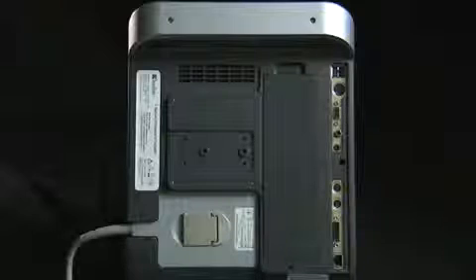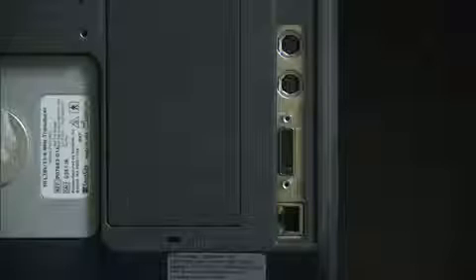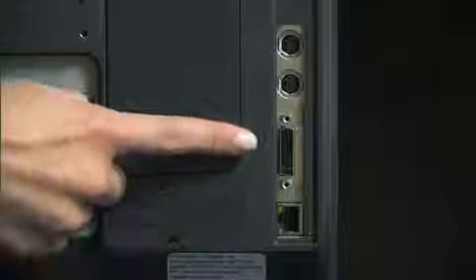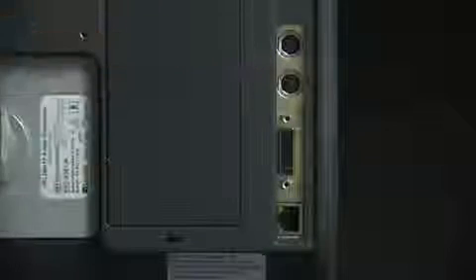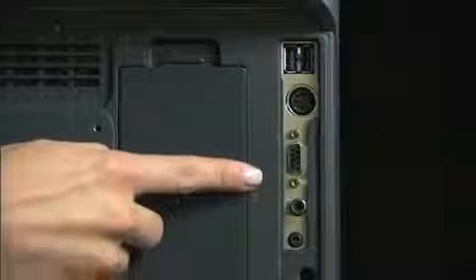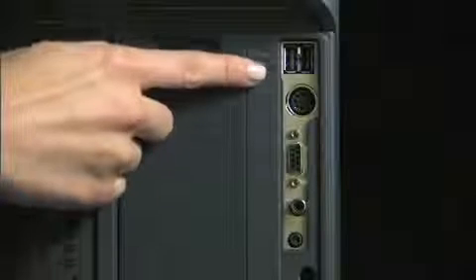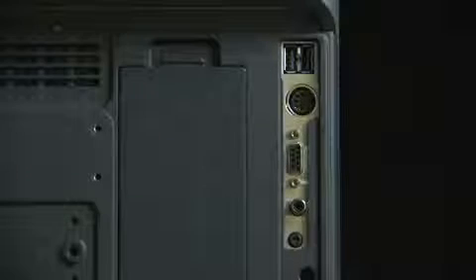On the back of the system is an embedded mini-dock for connectivity and data transfer. There are ports for Ethernet, digital video out, and 2 S-videos. There are also ports for an audio jack, composite video, a 9-pin serial or RS-232 serial port, power, and 2 USB ports. On the right side of the system, there is an additional USB port and an audio jack for headphones. The USB ports can be used for image storage and system software upgrades.